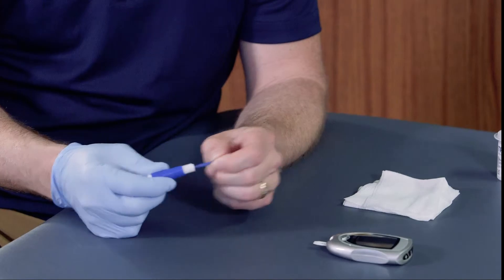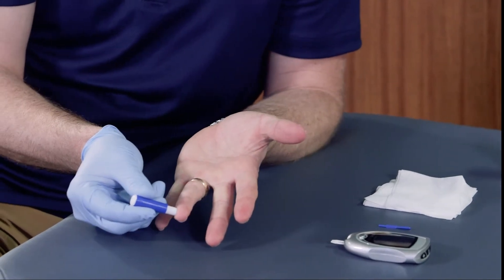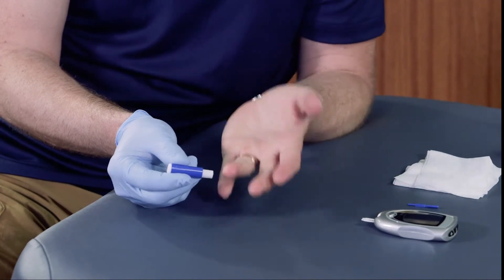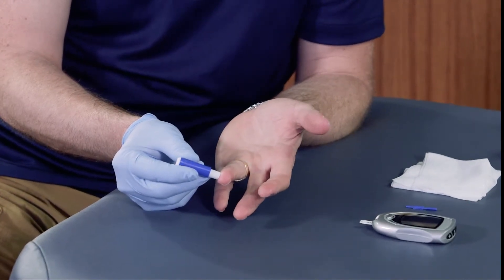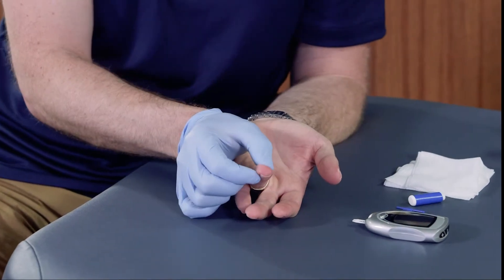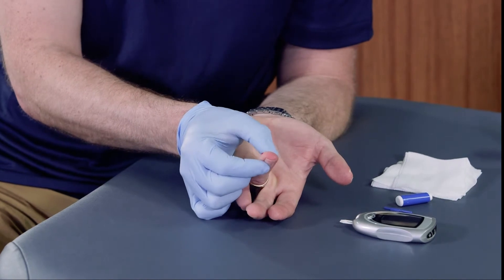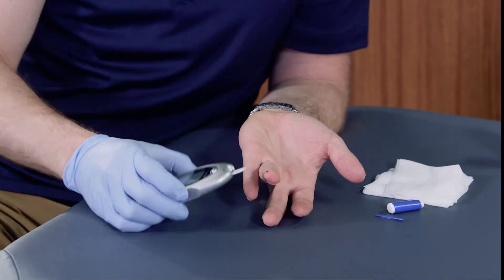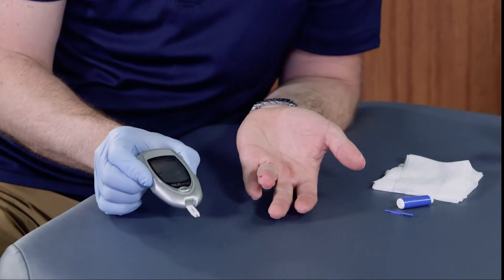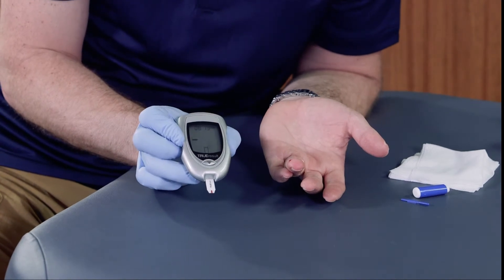This is a single-use lancet, so there's a needle that's going to come pushing out of the finger. Ideally you want to do it at the side of the finger so that when they need to use their fingertips they certainly can. I'm going to take this and push it in, and that gives me a small amount of blood. Then I can place the very tip right onto the strip so it draws blood up and in — and you can see it is starting to read.